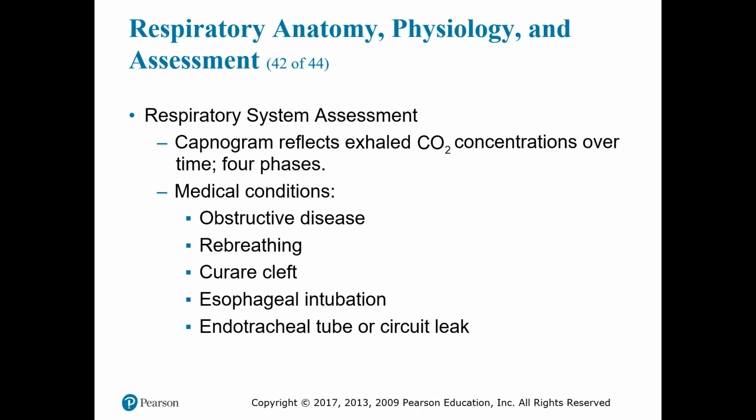You may see more rounded waves with no plateaus, because the pressure is not maintaining. Either the airway is too small and the pressures aren't reaching where they should be, or the sampling is not as accurate, or the cuff is leaking, or the vent circuit is leaking and not allowing a full breath measurement.